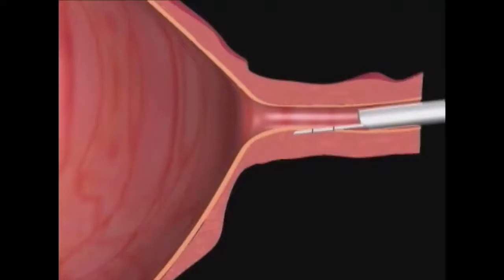It is important to use this tunneling technique to prevent an injection that is too superficial or one that is too deep.